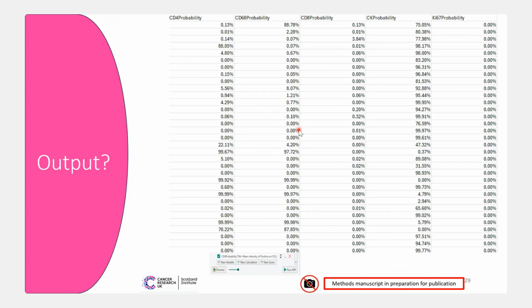So you just get your standard TSV that you can open in Excel, and then for each phenotype, you'll be given a probability based on if PixelMap deemed this nucleus to be positive or not, and then you could set your probability cutoff. So you could set how confident you want to be. If you want to be 50% and above, 70%.